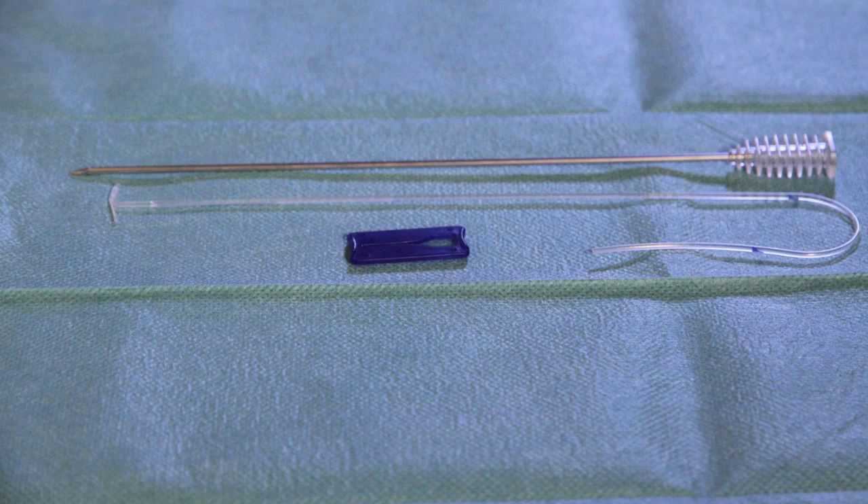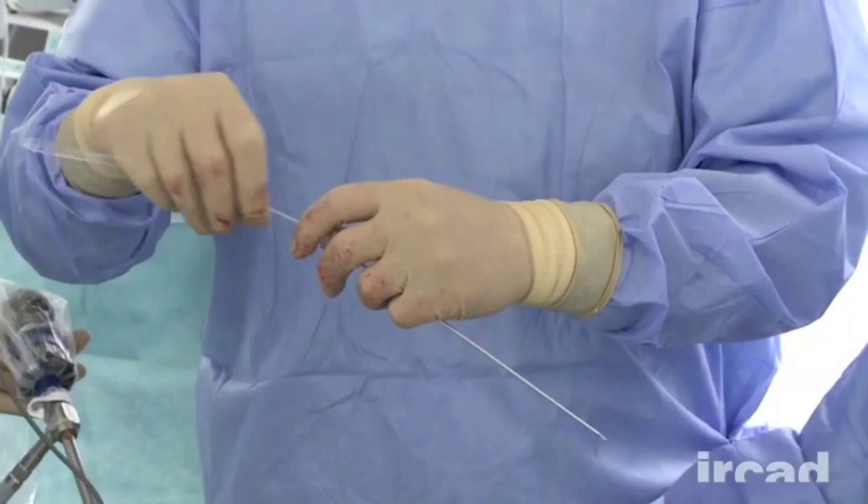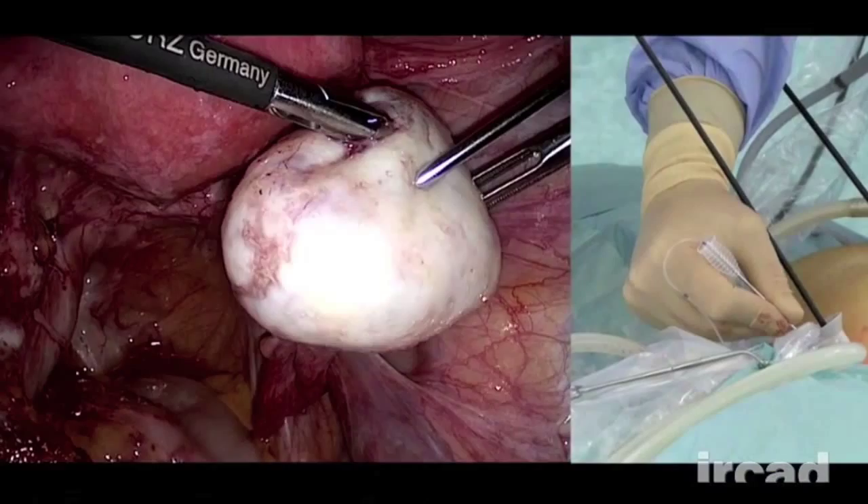The T-Lift is loaded inside the metallic introducer. The inserter is then passed through the abdominal wall and through the structure that is to be suspended. The T-Lift is pushed and its arms open up, taking a T-shape.